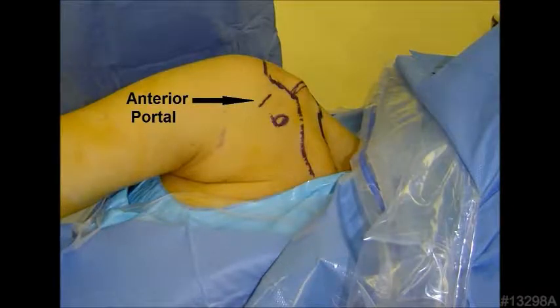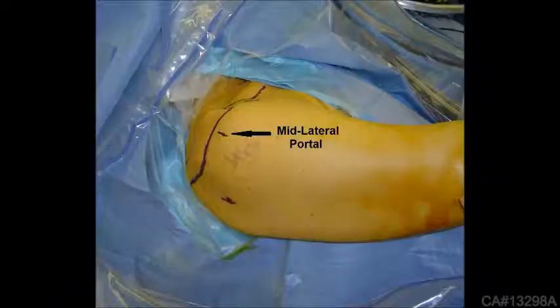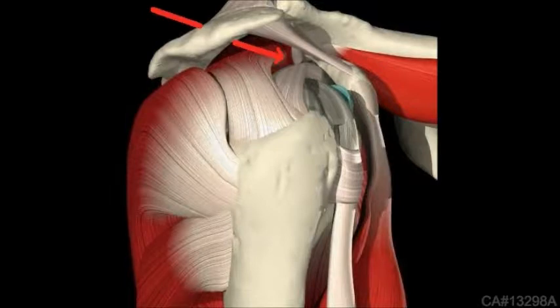Surgery can be performed either in the beach chair or lateral decubitus position. The release employs a standard anterior working portal. A mid-lateral portal is utilized for visualization. The release is performed through a small stab wound Neviaser portal.